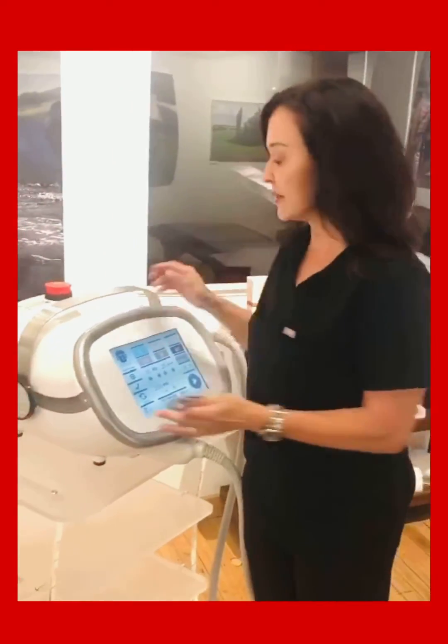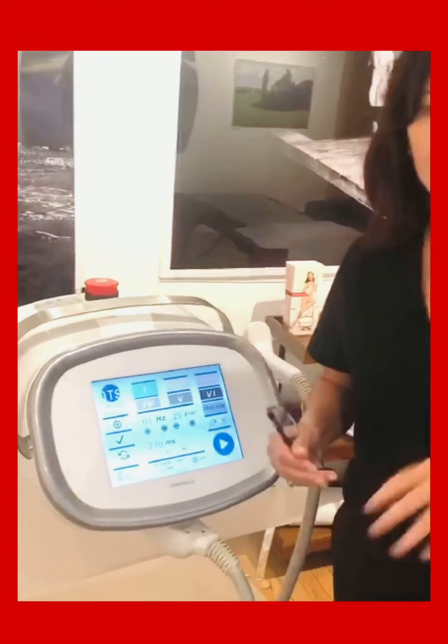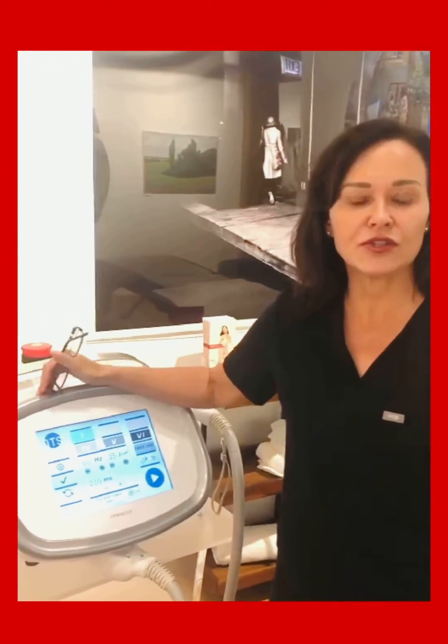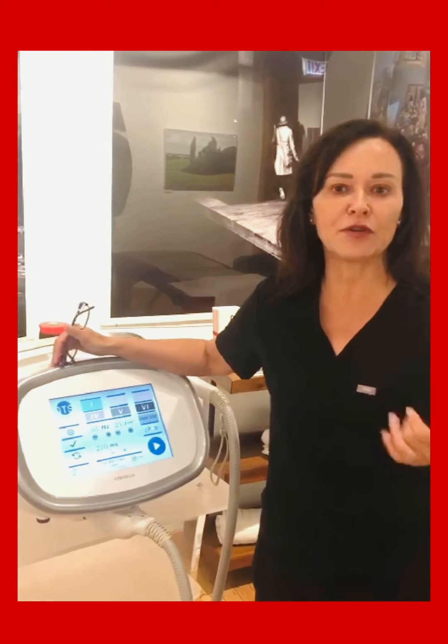It's exciting to know that you want to know something about the device. So, what happens is we have two modes: basic and free use. Basic mode allows you to choose skin type, dual power, and how fast we want to fire it — how many pulses per second.